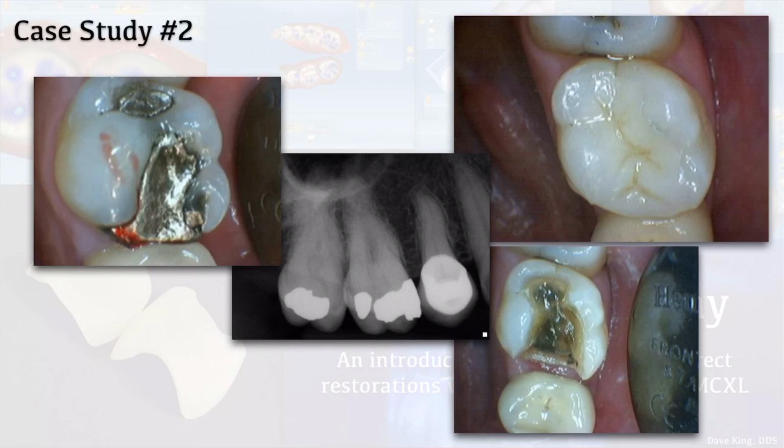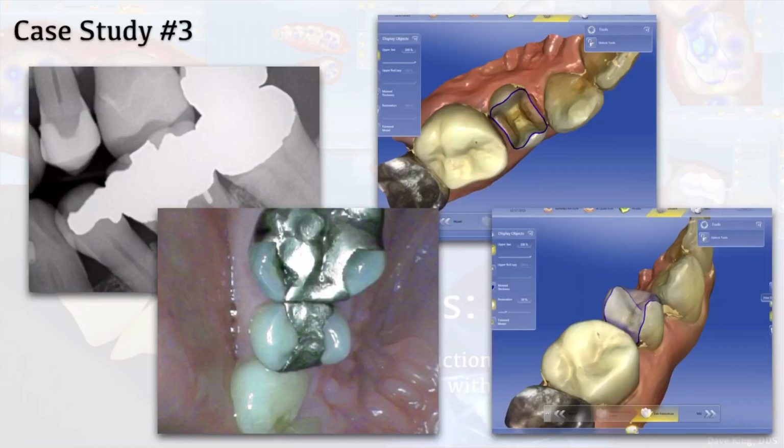Probably, honestly, I'd go for a crown on that tooth. Although this may be a great solution. My worry is with that little line there, that could potentially be a remaining fracture. It might just be a marginal ridge groove, but at the same time, I'd crown it. I probably would have crowned it, but this is a great middle of the road option. An inlay.